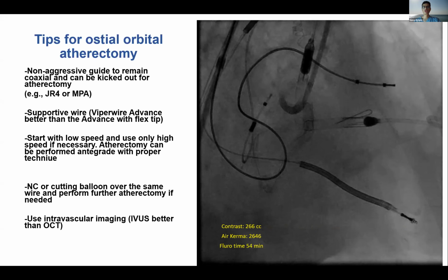A great question. And actually, some people are using Rota-lithotripsy, so they kind of use combined. They use atherectomy first to get some channel to deliver the IVL balloon, because as you said, it's not the most deliverable balloon in the world. And then just to make sure it's fully expanded, people have used intravascular lithotripsy after atherectomy.